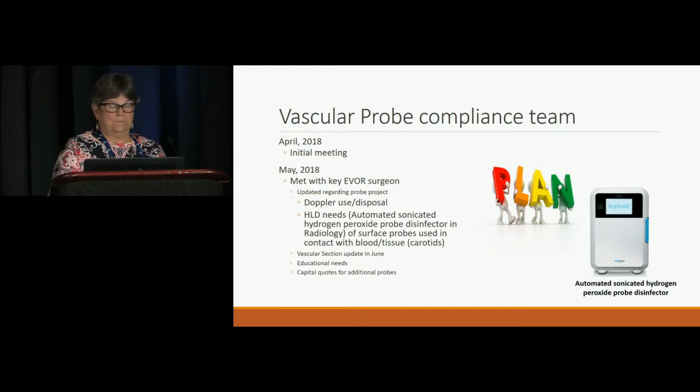So we did let the physician know that. He was quite supportive because we wanted him to know there would be a little delay, perhaps, from what he was accustomed to, which was formerly just a wipe down and stick on another sterile cover between cases. But he was going to have at least 7 minutes for the disinfection process after the cleaning had been done.